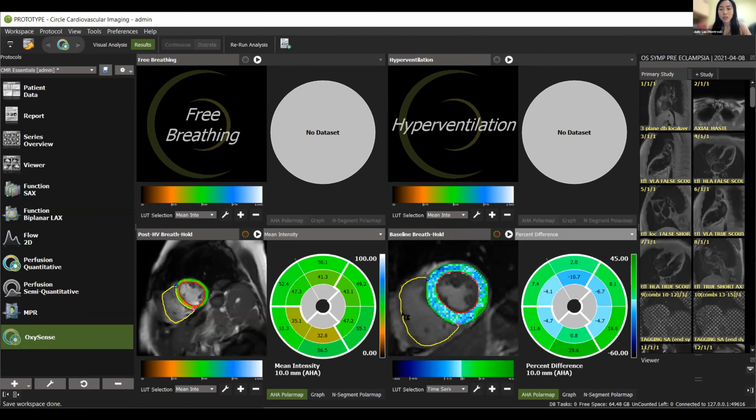Yeah. And to add to that, the decision to analyze end systolic versus end diastolic is one of history. It was when I was doing my doctoral studies, and I found that the myocardium obviously is thicker in end systole, but we all know the cardiac cycle, the myocardium perfuses at end diastole. But back then the technology wasn't available to pull out that signal intensity in diastole.